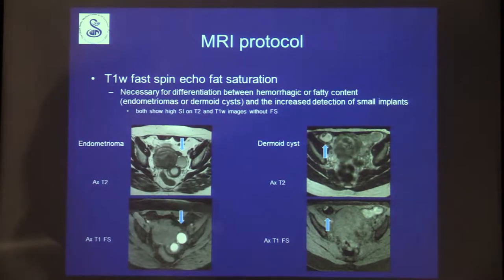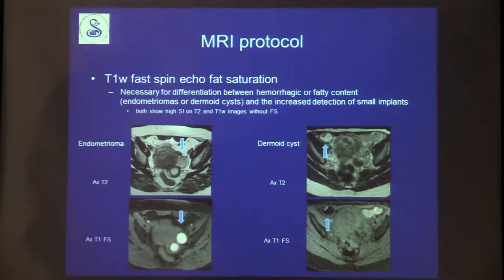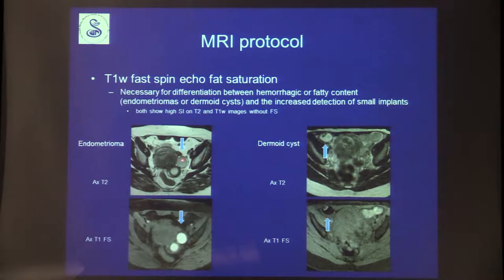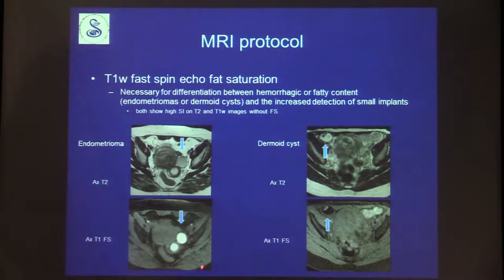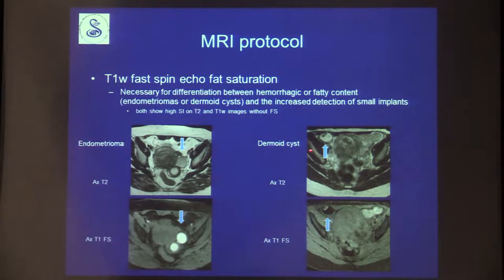Fat-saturated T1-weighted images are necessary to differentiate between hemorrhage and fat inside ovarian lesions. You can see the endometrioma here — it remains bright on T1 fat-sat — as opposed to a dermoid cyst, which was high on T2 but lost signal on T1 fat-sat images.